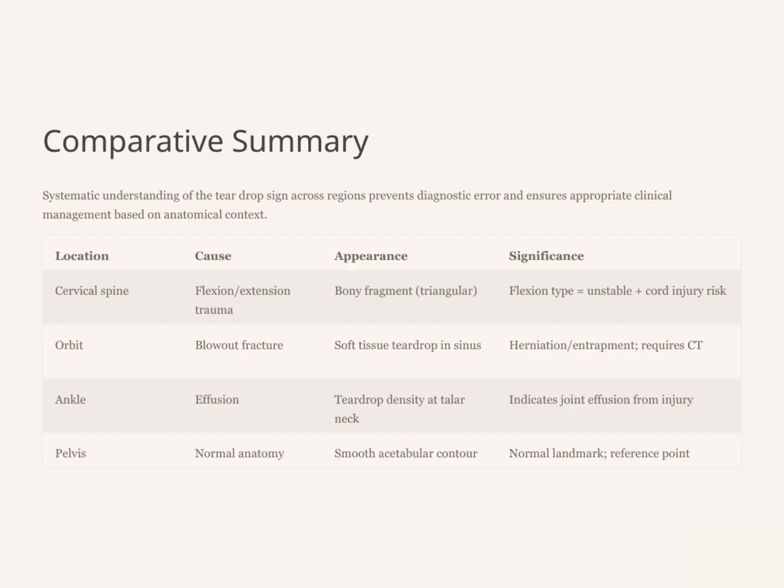Overall, understanding these variations of the teardrop sign across different regions allows us to make more accurate diagnoses, avoid mistakes, and tailor our management strategies effectively.